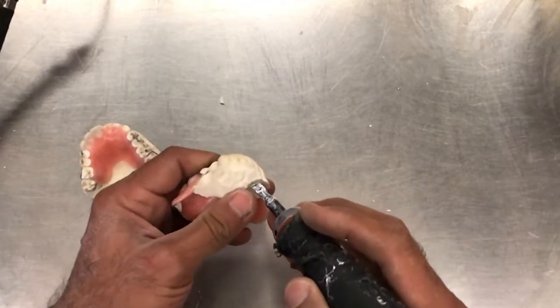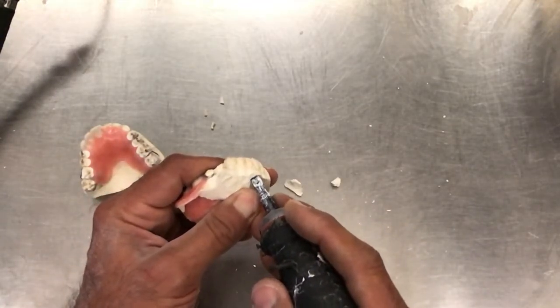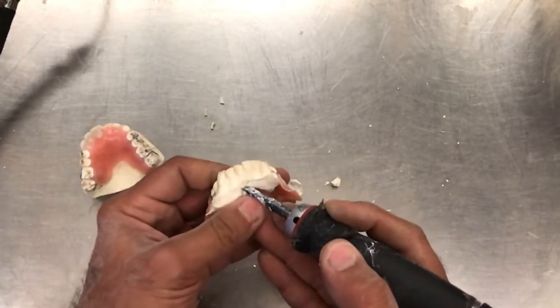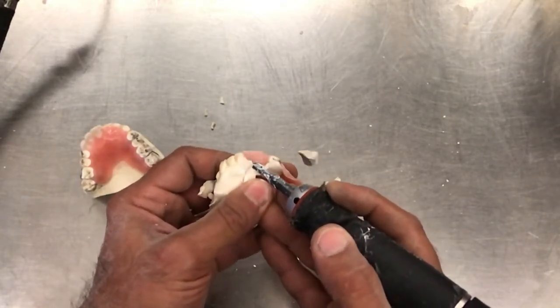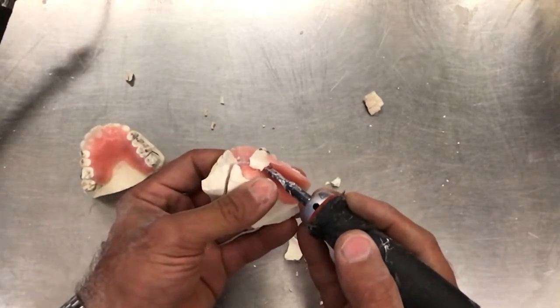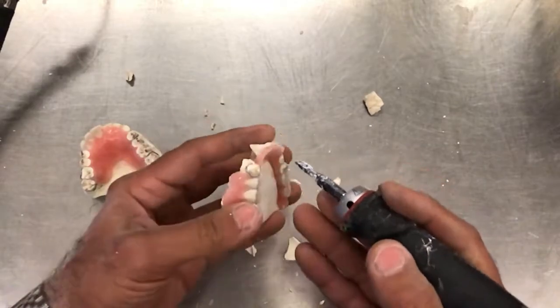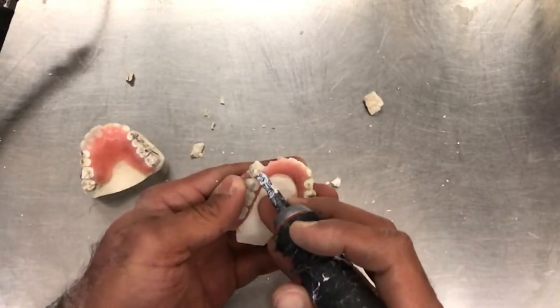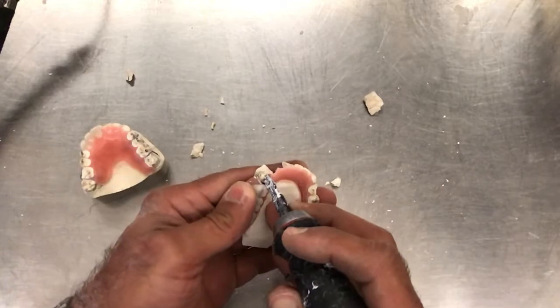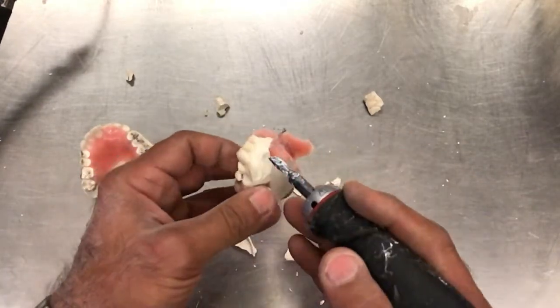Gently chisel away. Don't create too much pressure. And if you separated the case properly during investing, you shouldn't have any problems here. So you can see everything comes out rather clean.